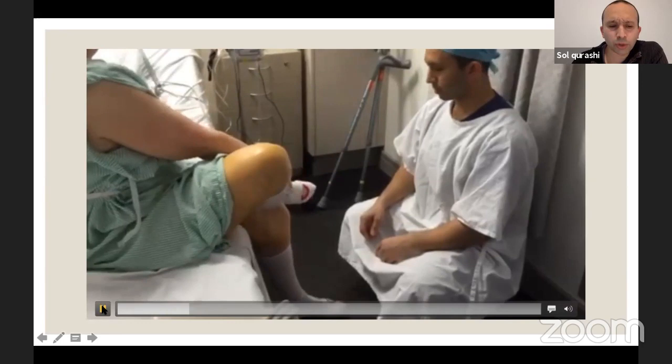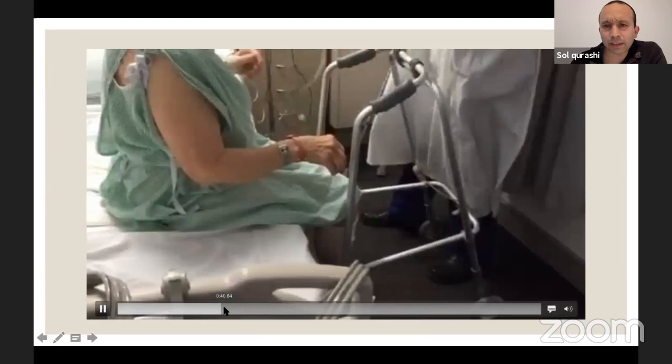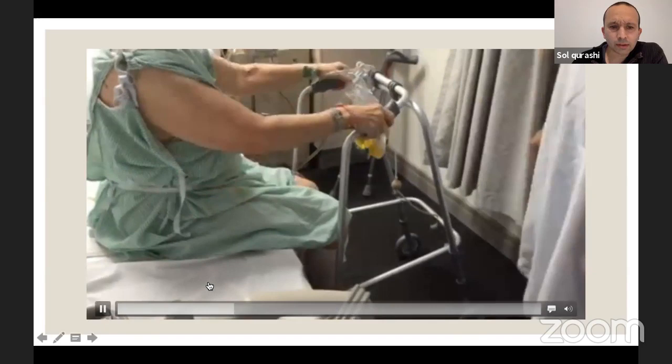Right. So what we'll do now, this was about 5 years ago. I was using catheters. Now we don't use catheters anymore. So you see, they rise very easily because of the intact ITB. I'll go to the front. That way.